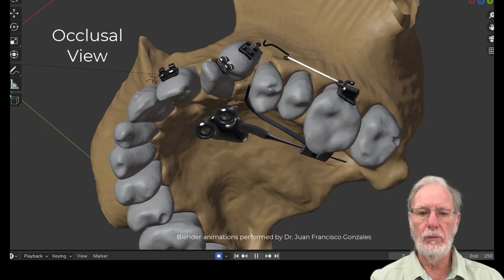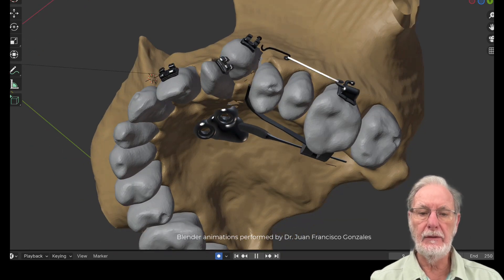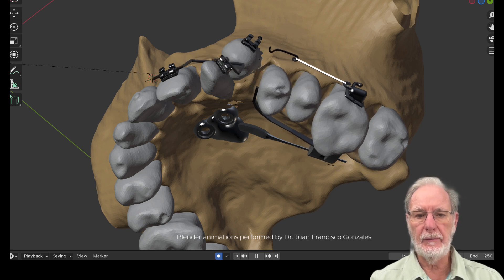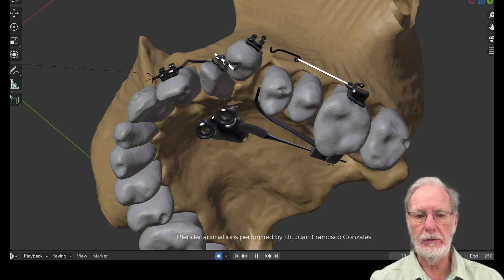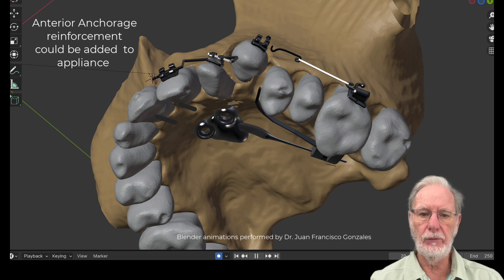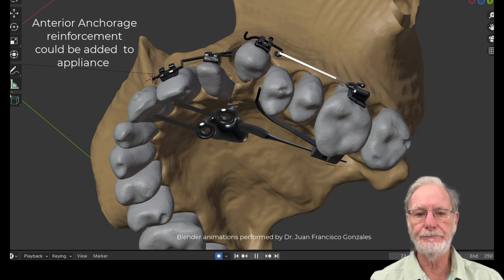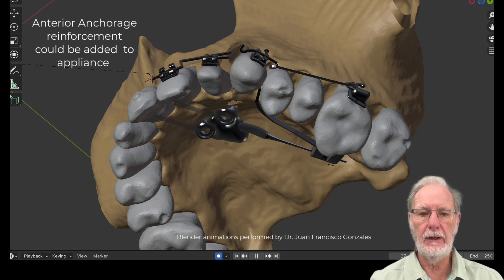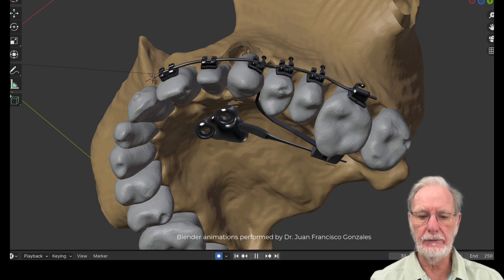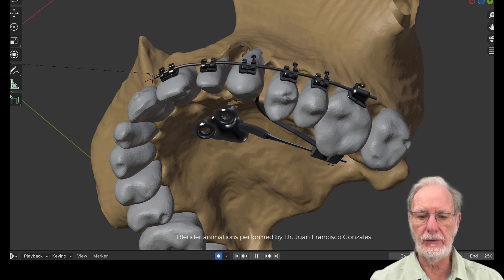The wires are bent and we're still in the segmented approach. We can add some anterior anchorage — we didn't do it, but it's feasible if you want to. Then you finish with straight wire as we saw before. So that's the animation.